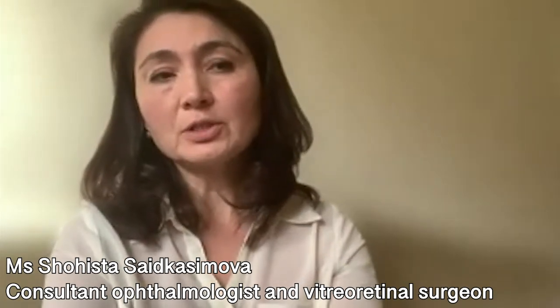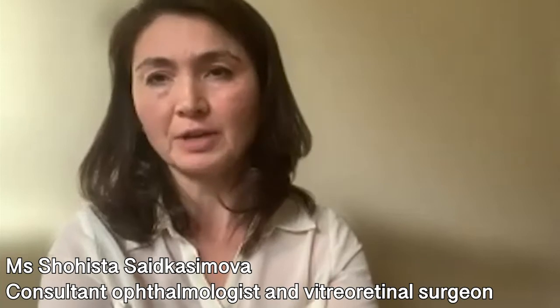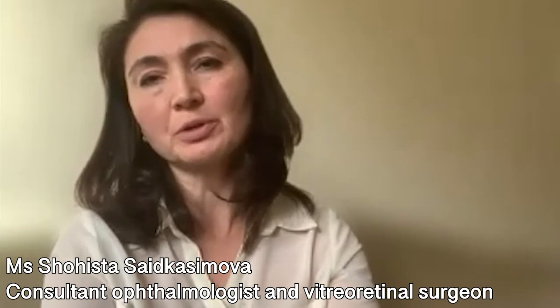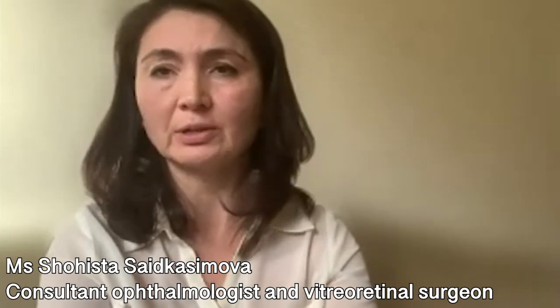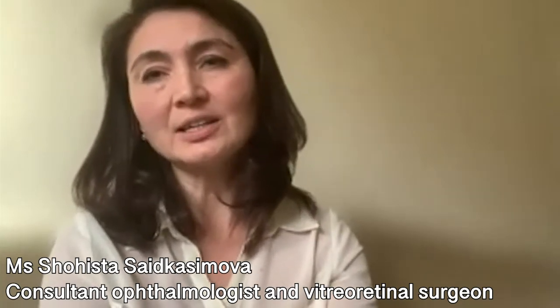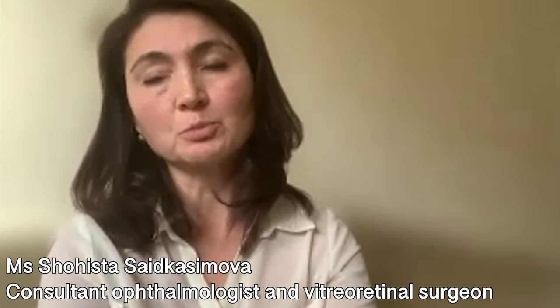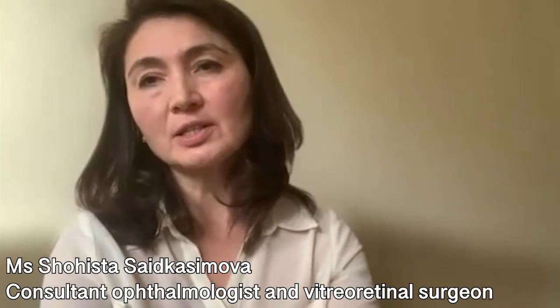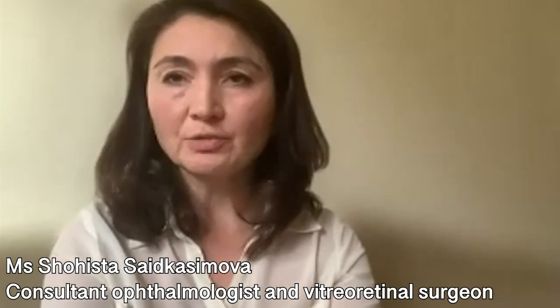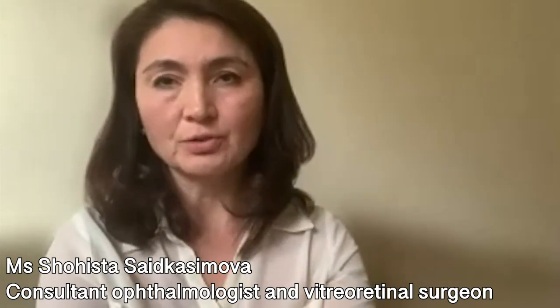There are also smaller complications. These will include unexpected refractive errors. That is when we calculate the lens and estimate the power that is required for the patient to be able to see the distance without glasses, or in the case of a multifocal IOL, not to have glasses for distance and near. But despite those accurate calculations, occasionally we may have unexpected refractive surprises. In this case, there are a few options that we will discuss with patients, but briefly they will include exchange of the lens, a second piggyback lens, or even additional laser refractive surgery to compensate for that.